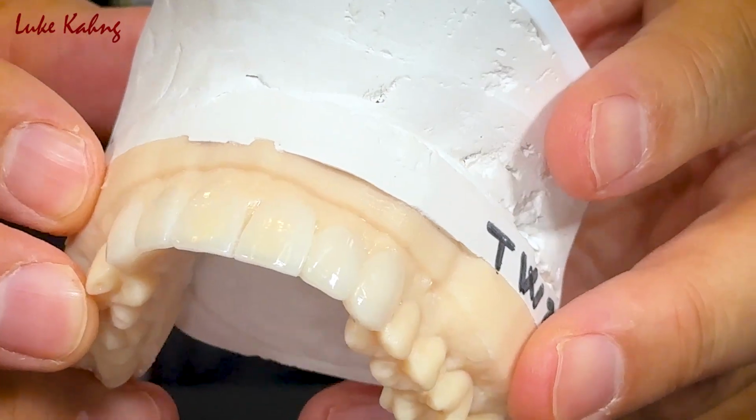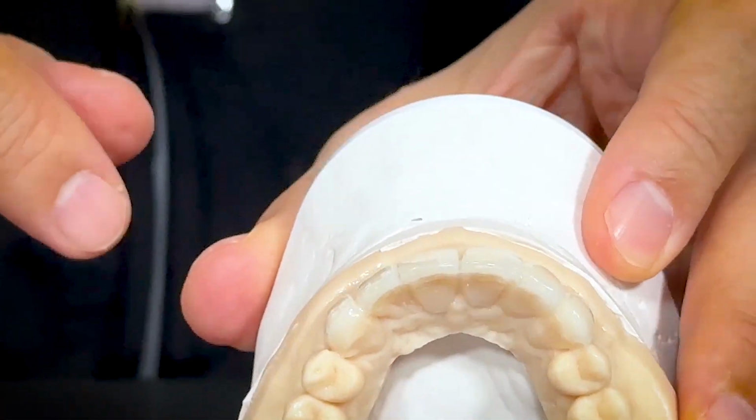here. But what I do is treat it just like a dentist, okay? A dentist cannot prep much. I know, I'm a laboratory guy, right? My laboratory guys all the time need a lot of room, okay? Dentists cannot prep the room, understand? I have to make it as minimal as possible, just like a dentist.